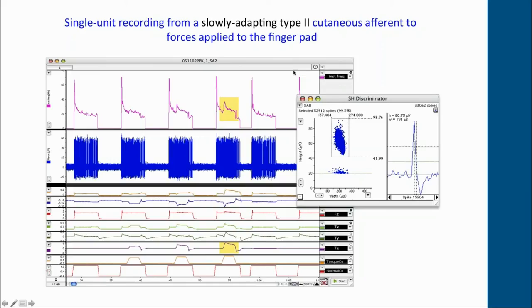I actually went to the headquarters of AD Instruments in Dunedin and worked with the software engineers there to get that template-matching functionality built in. It's not yet fully applied to the Macintosh version, but as you can see, the Mac version is still very much adequate for extracting very clean spikes from a recording.